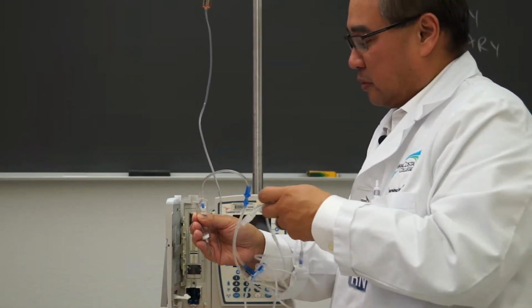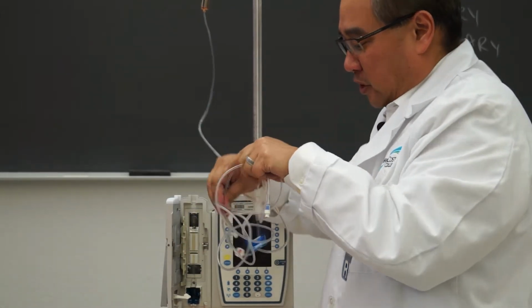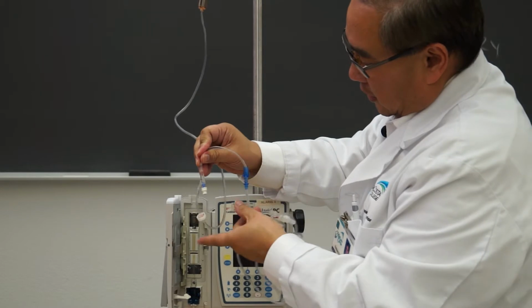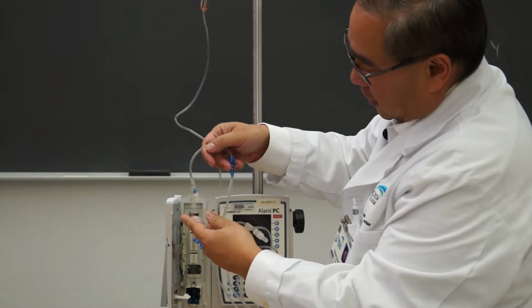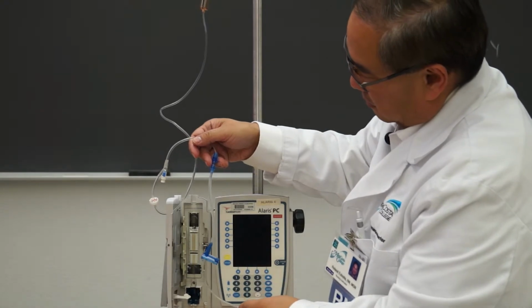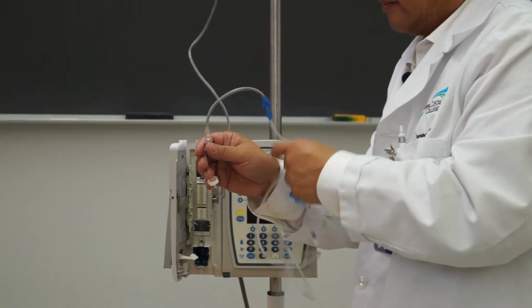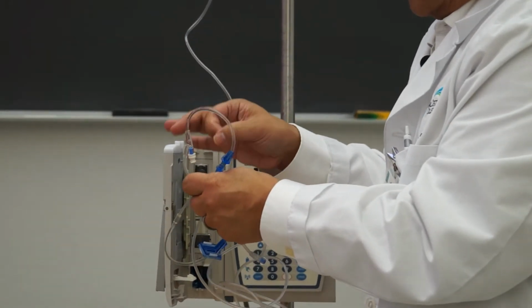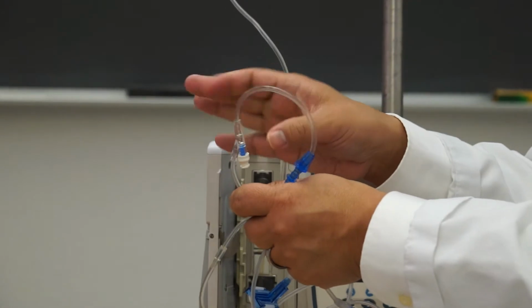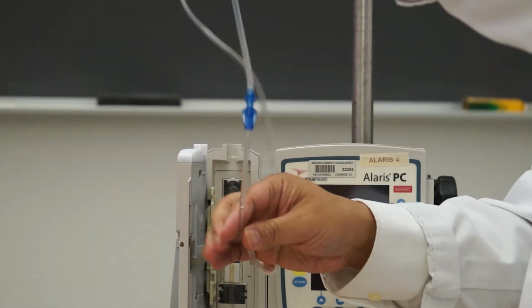See, there's the bubbles moving right there. Okay, when it gets to the Y site, I'm gonna change hands. Sorry, it's gonna be a little bit. Here comes the fluid. Okay, I'm gonna flick the Y sites now. Okay, so I'm gonna hold it here for you to see it. See the air, the air here. There it goes. Okay, I'm always gonna follow the last bubble though.